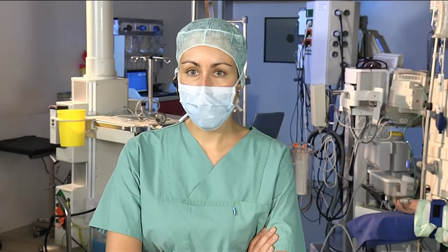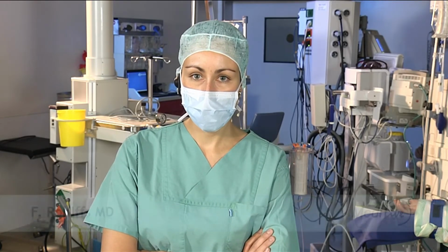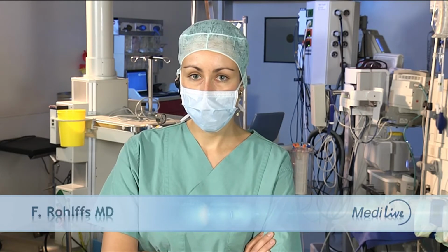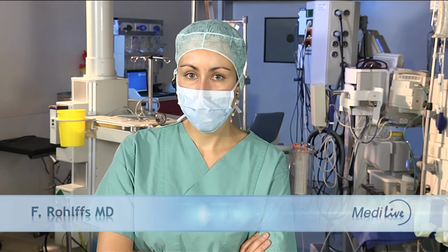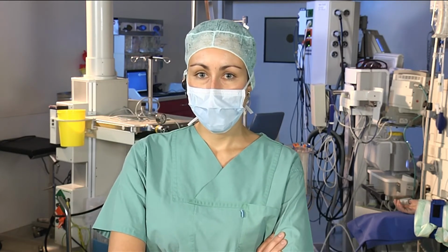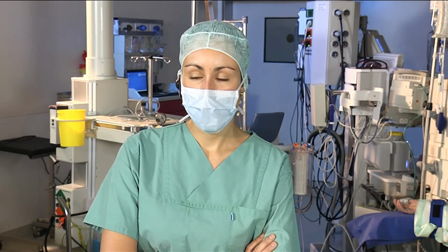Thanks very much. Very nice case, very nice completion. Angio at the end, complete closure of the false lumen, at least in the thoracic part. Yes? Fiona, good morning. This is Stefan. Right. Can you tell us how you sized the candy plug, please?